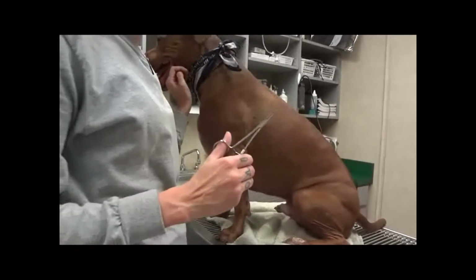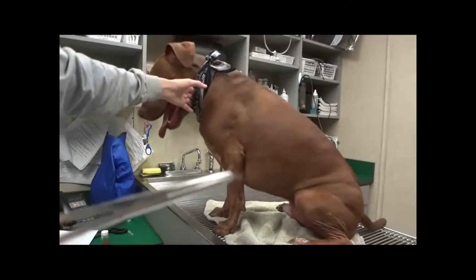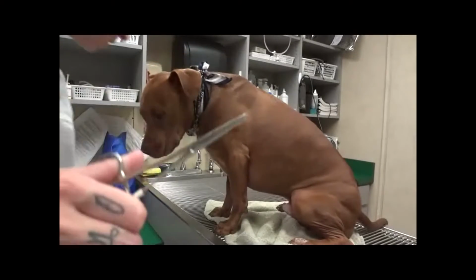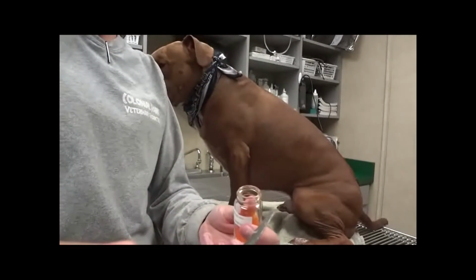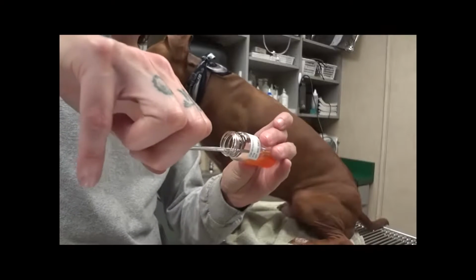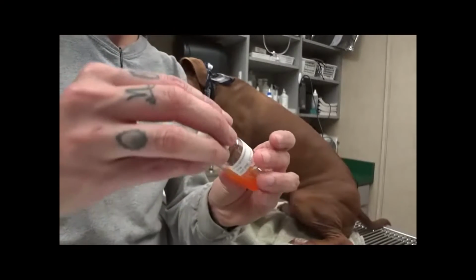Alright, we're going to use the hemostats to pluck 10 to 20 hairs. And we're going to place those hairs in the medium, being sure that we don't bury them. And just place them right in it without completely submerging them.